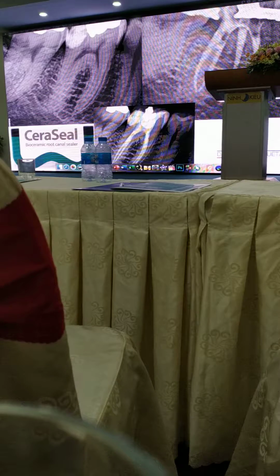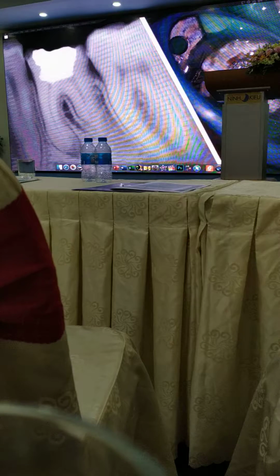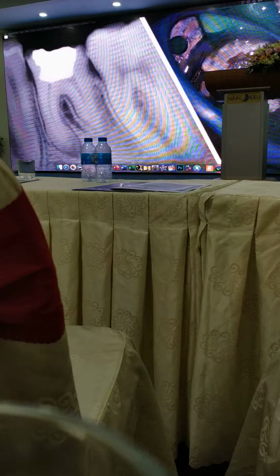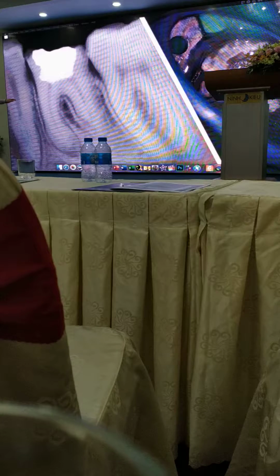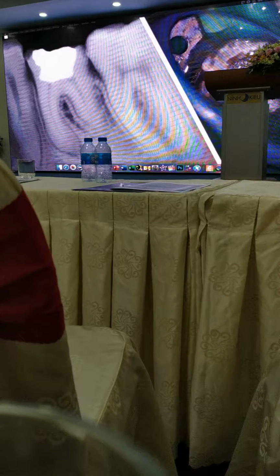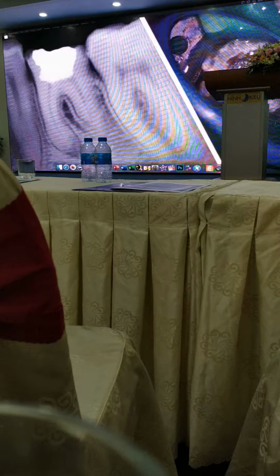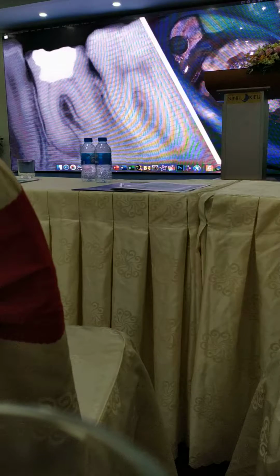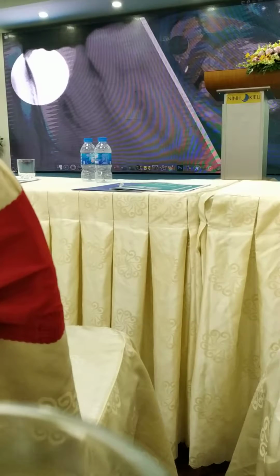We can obtain cases like this, and we can also use this obturation technique for saving teeth. This is an interesting case in which my prosthodontic department at the university wanted to extract the tooth. I asked them why, and they told me, you know, Jenner, if we prepare that molar for a crown, when doing our preparation for the crown, we will remove this structure.